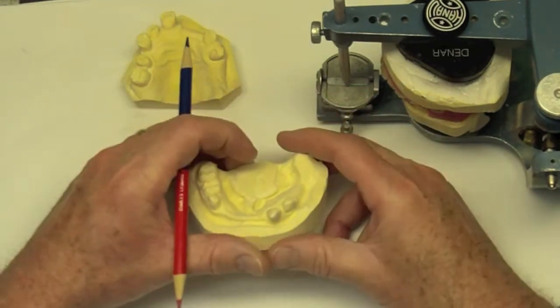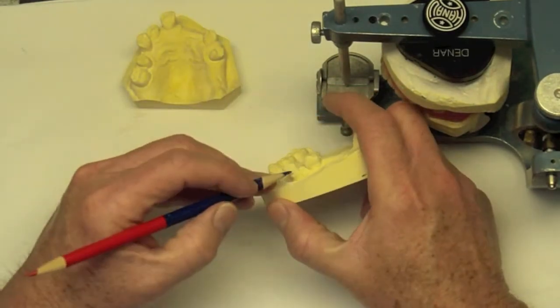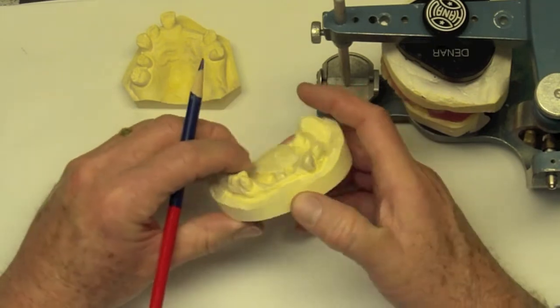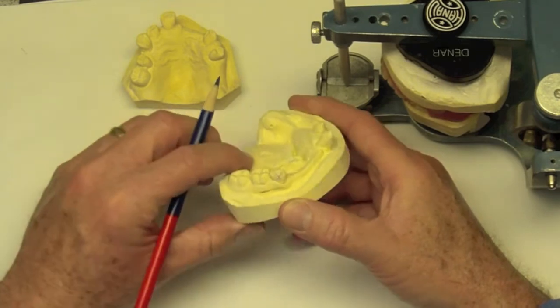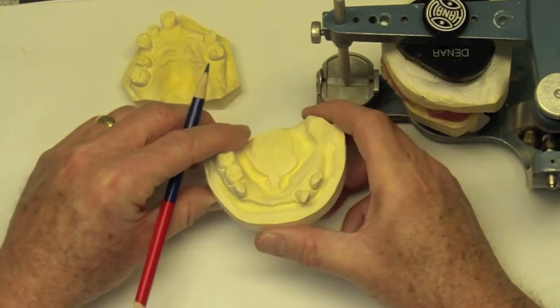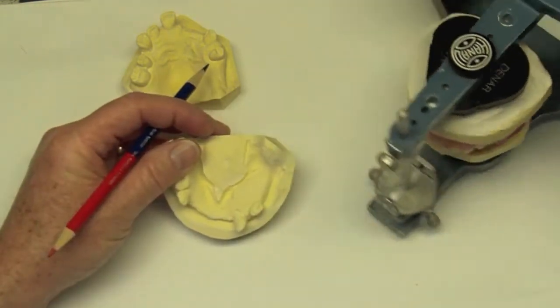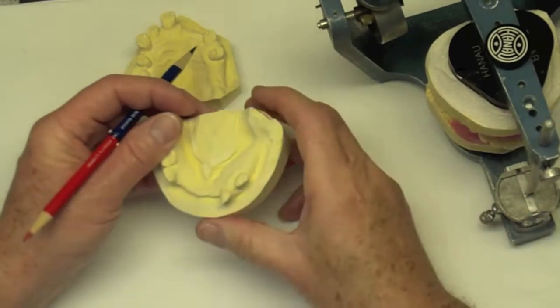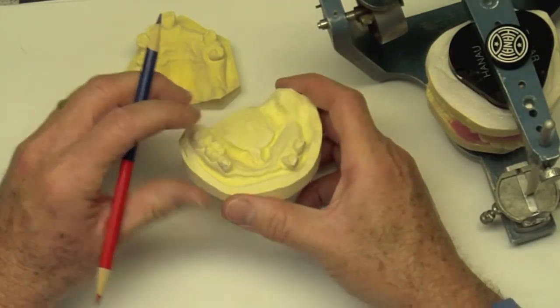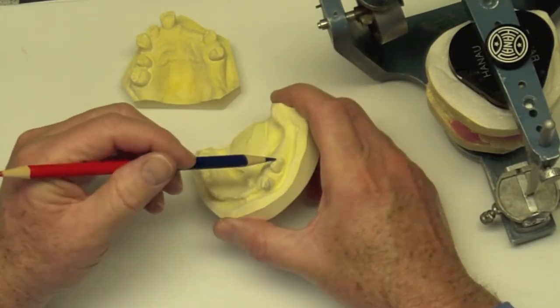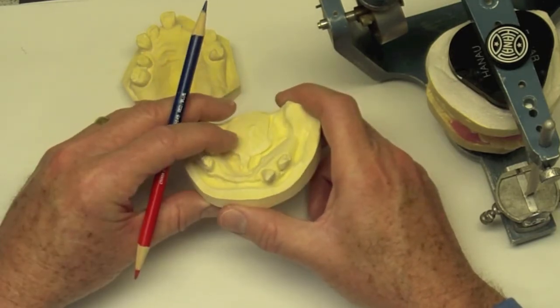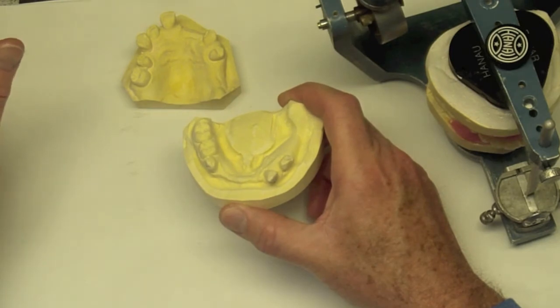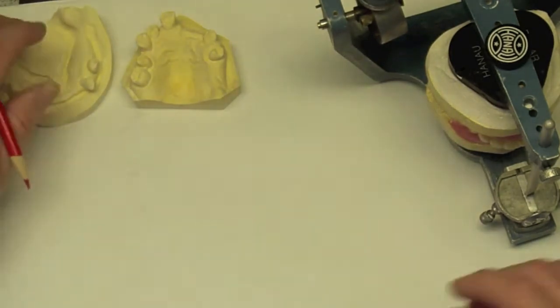Not too dissimilar situation on the lower. Again, we have proclined canine. This one's not in too bad a position, but again, we have issues with periodontal disease. So we're going to go ahead and remove those two teeth and retain these two molars and this premolar and fabricate what's going to be an immediate interim removable partial denture.